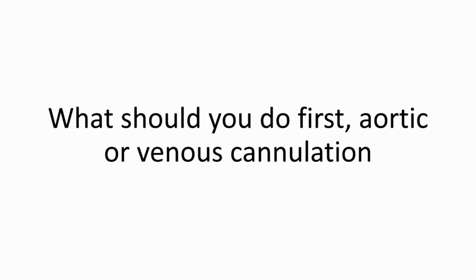The key thing here is to understand how we measure the effect of heparin in theatre. Yes, Agatha, well done. Muhammad, we give heparin, not warfarin. Heparin. Not cardioplegia. We have to give cardioplegia for a different purpose, but we don't have to give cardioplegia to safely get the patient onto bypass.